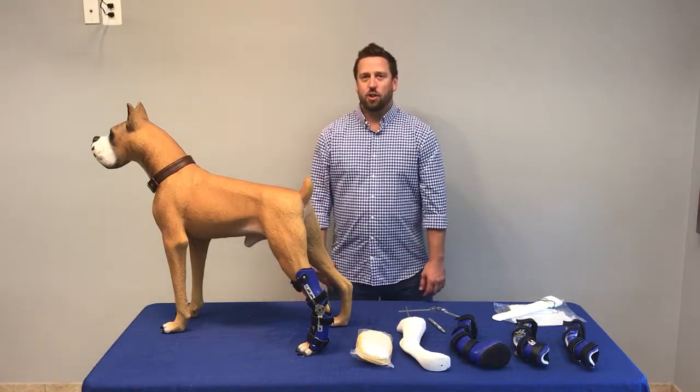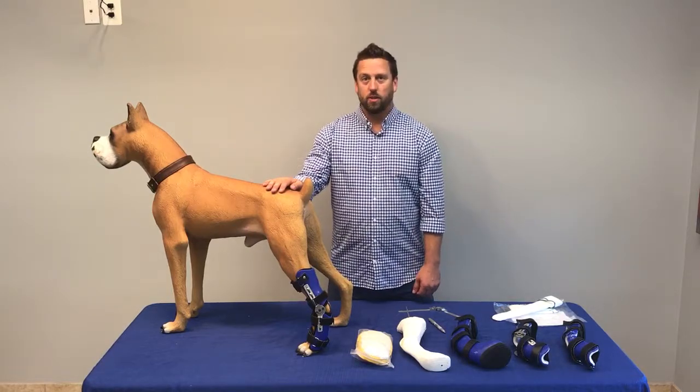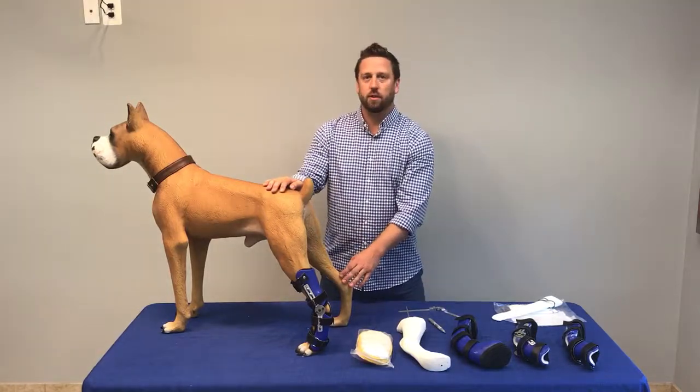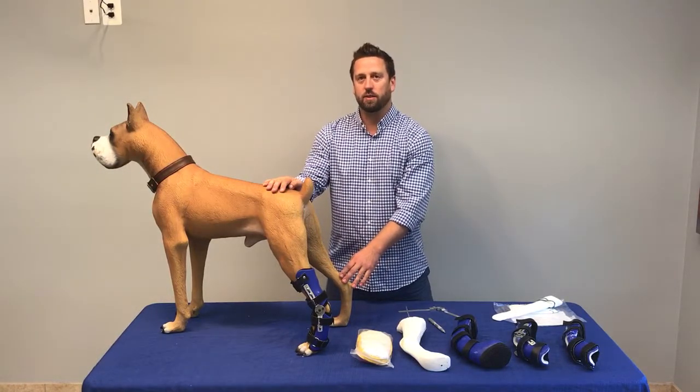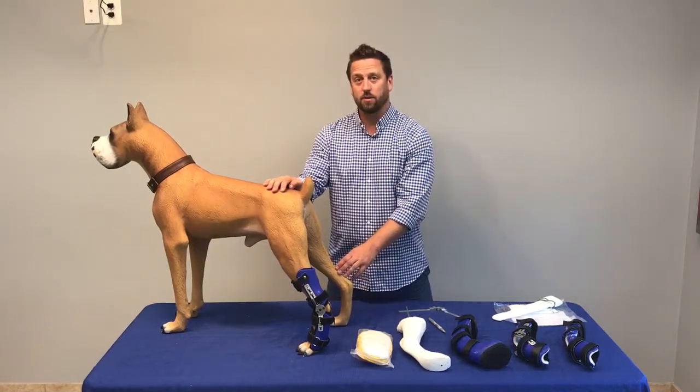Hi, my name is Derek Campana. Today I'm going to show you how to fit a hock brace, otherwise known as a tarsal brace or ankle brace. We most commonly use these for post-op Achilles tendon repair instead of an external fixation device. It can also be used when surgery is not an option for the pet.